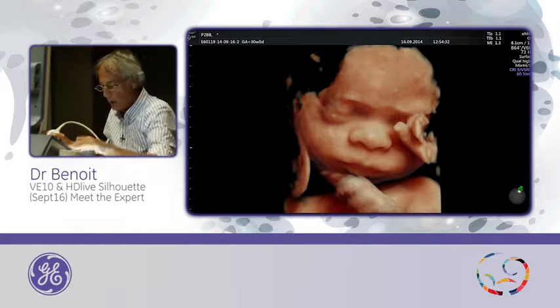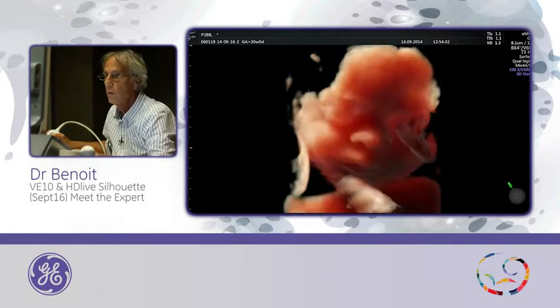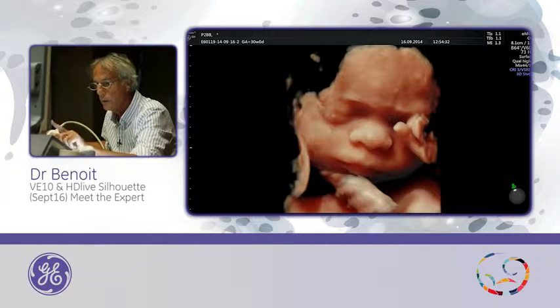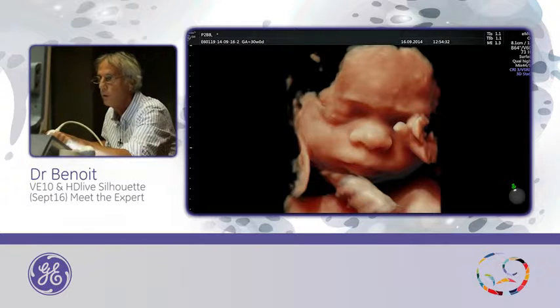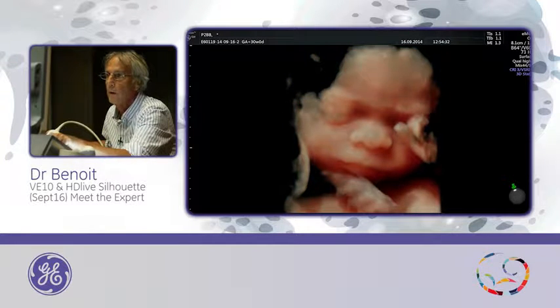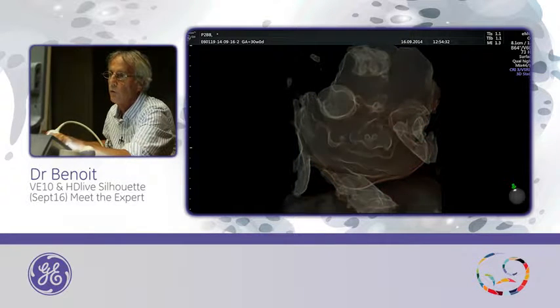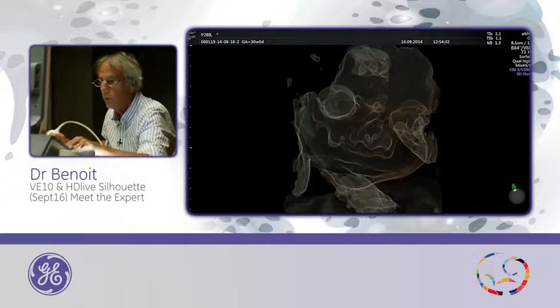This is a classic HD Live. You can move the position of the light. And now I will increase the silhouette, and you will see the result. This is a silhouette. When you increase the silhouette, you can see in transparency, but it's not so nice. You cannot use it like this because it's not really nice.